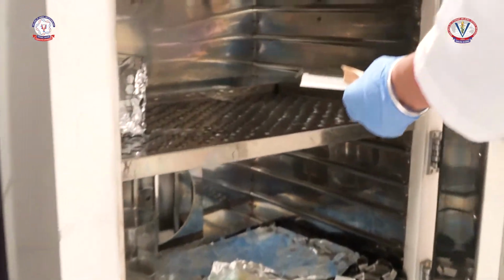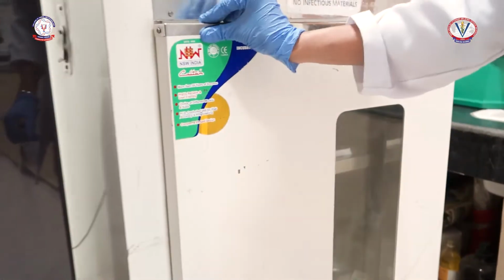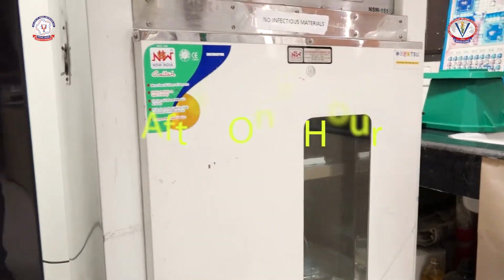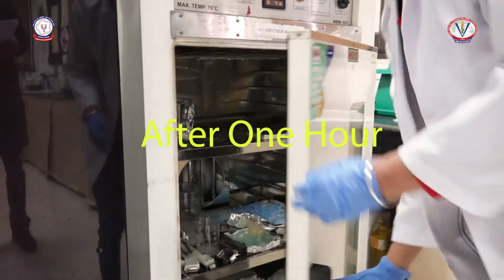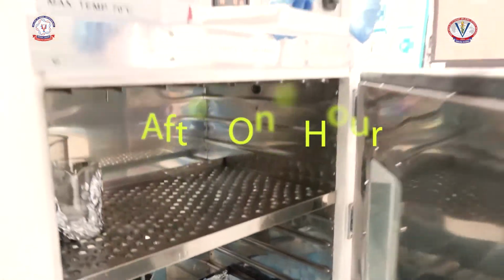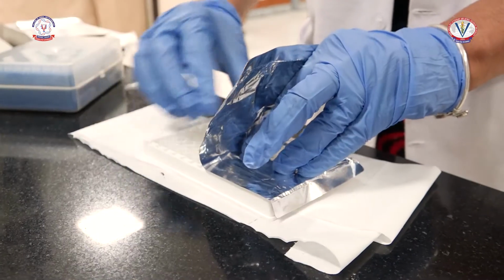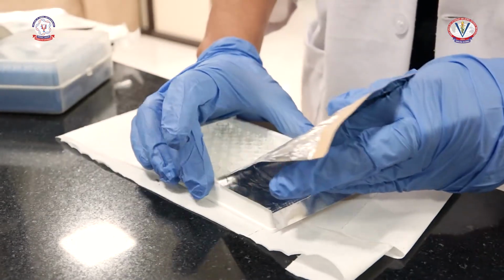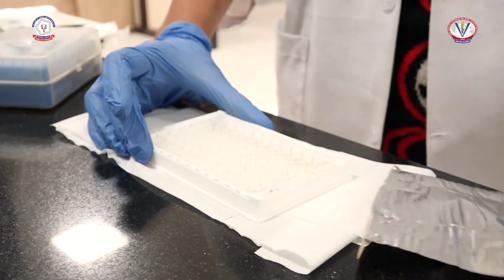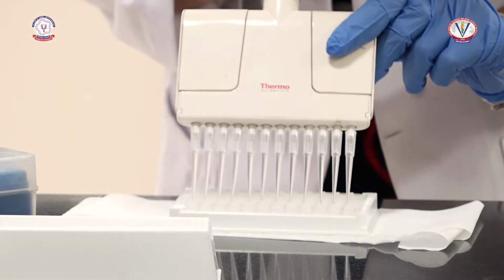Then the plate is incubated for 1 hour at the temperature of 37 degrees Celsius. After 1 hour of incubation, the plate is washed with washing buffer.